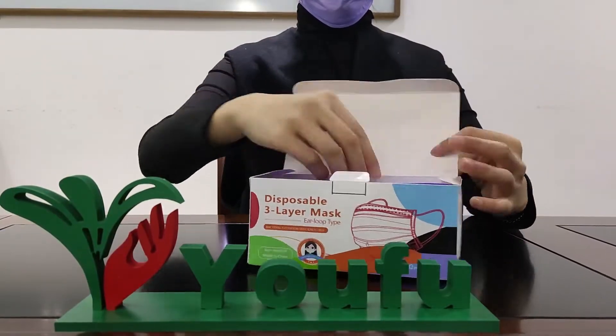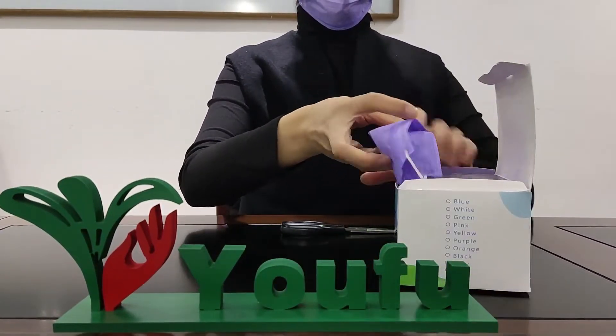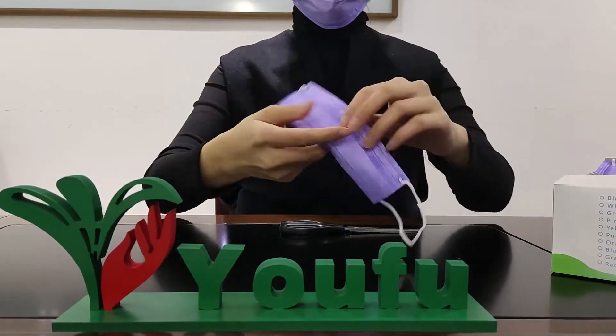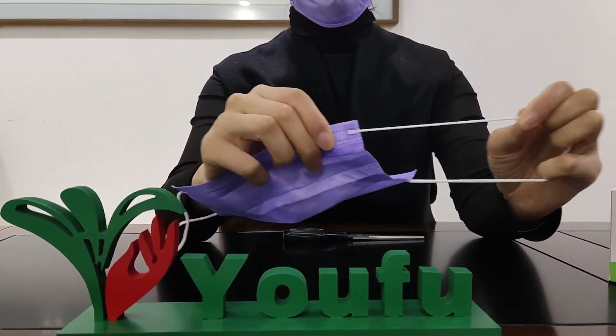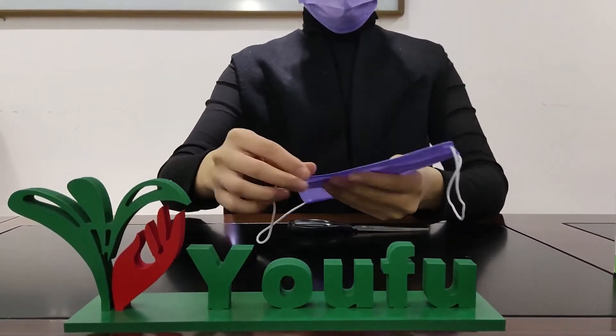Let's have a look at our high-quality purple disposable face mask. The ear loops are with great elasticity, and it's ultrasonic welding which is not easy to be pulled apart.